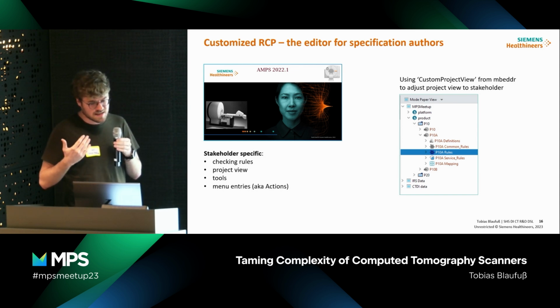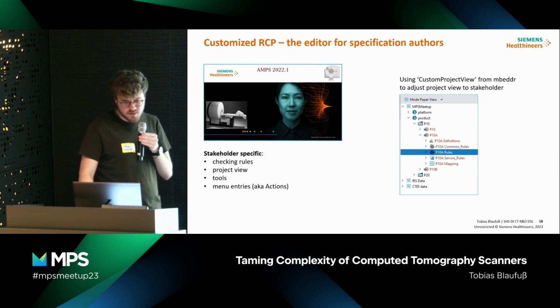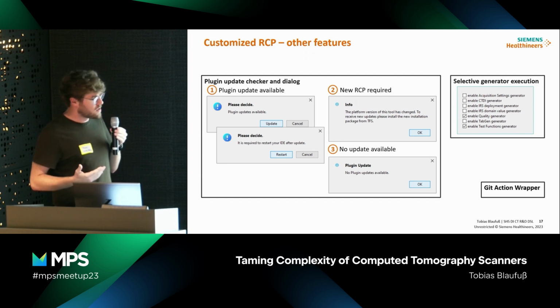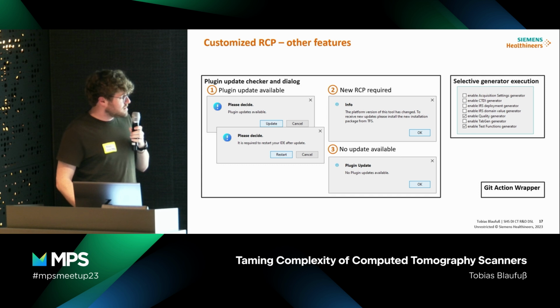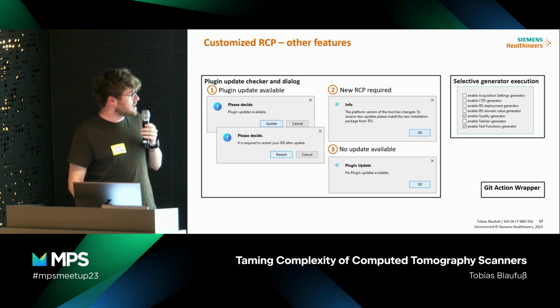It doesn't make sense that we should solve problems that only physicists can solve, for example. We also have an update checker in place that is a little bit more obvious, because for our non-technical users this tool is not always so easy to grasp. And we can update our plugins on the spot here.